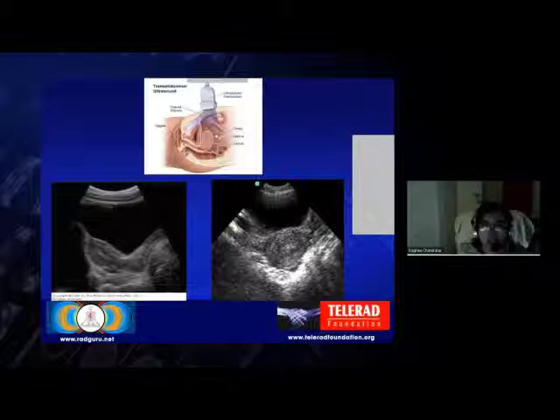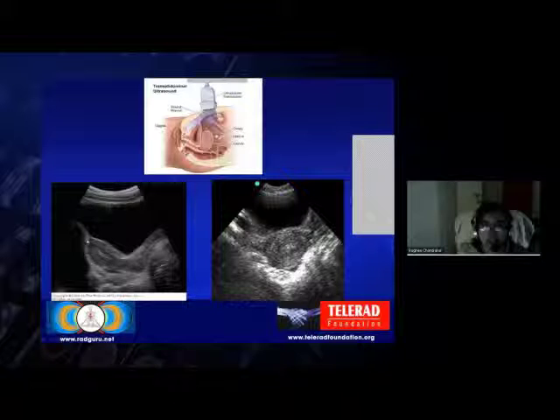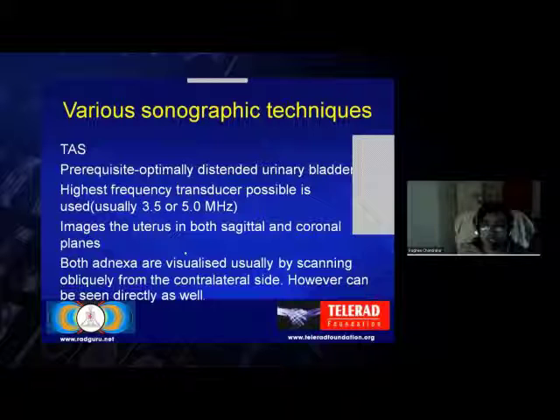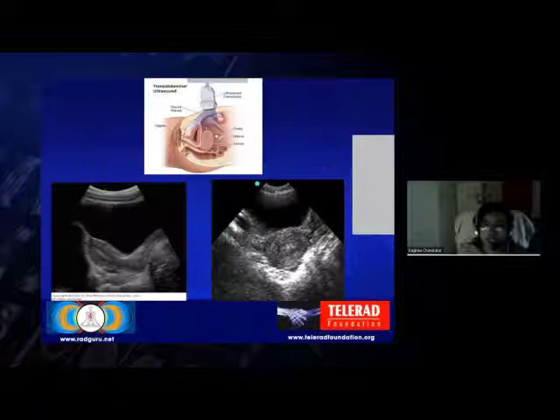Images are taken in both the sagittal and the coronal planes. We can see here the long axis or sagittal images of the uterus, and the second is the transverse or coronal image of the uterus. Both adnexa are usually visualized by scanning obliquely from the contralateral side, though direct visualization of the adnexa is also possible.